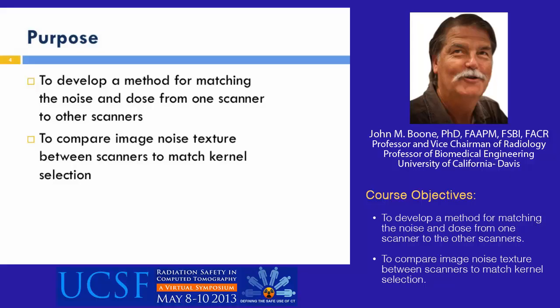The other purpose is to compare image noise texture between scanners to match kernel selection, and this I'll talk to you about from a recent paper that was published in the literature from Duke University that I thought was quite interesting and useful in this regard.